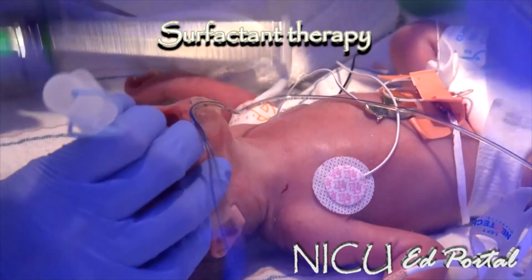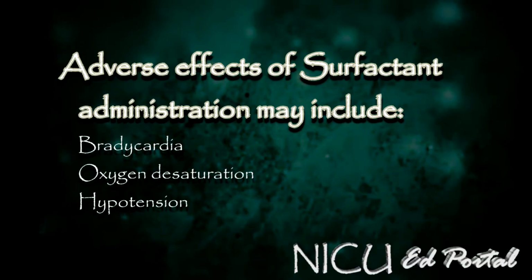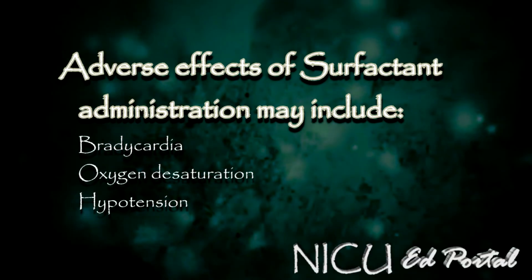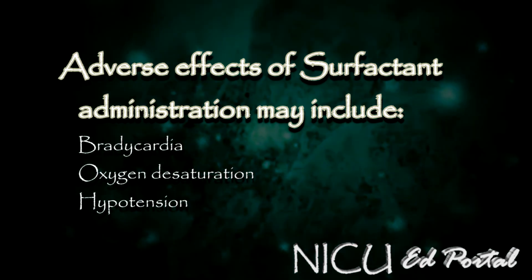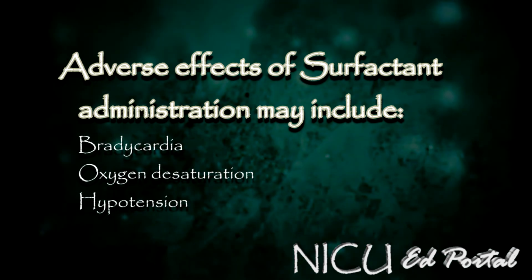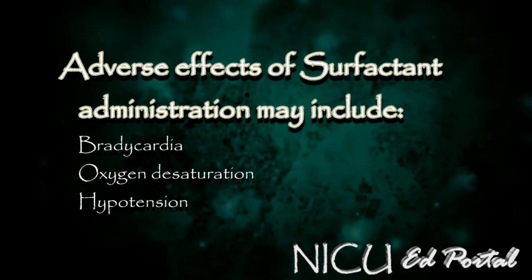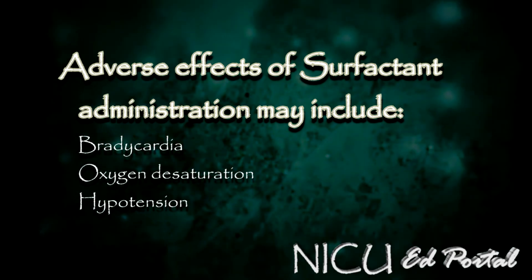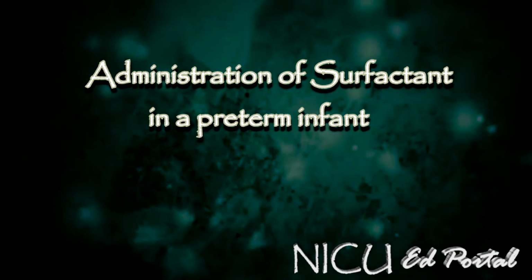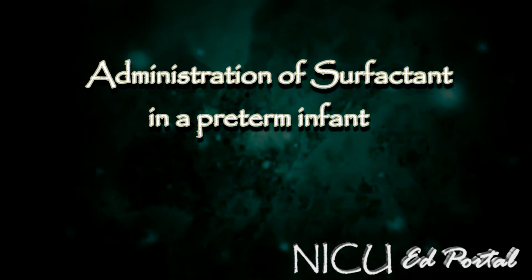Prior to administration, it is important to ensure proper placement and patency of the endotracheal tube. Transient adverse effects of surfactant administration may include bradycardia, oxygen desaturation, and hypotension. Therefore, it should only be administered by those who are trained and experienced in the care, resuscitation, and stabilization of neonates. There are several different ways to deliver surfactant replacement therapy to a neonate.